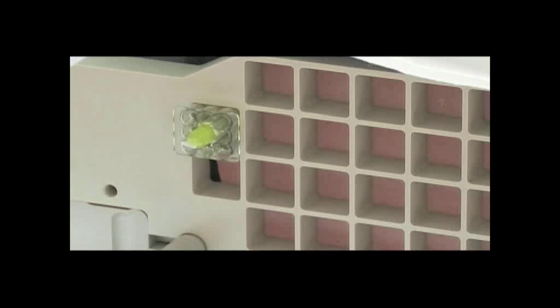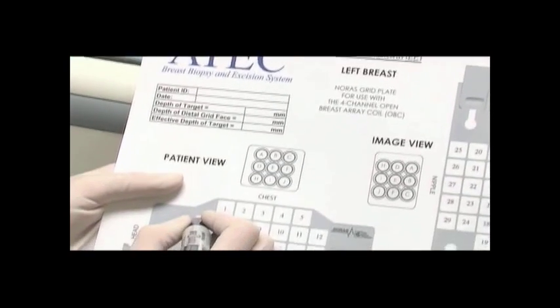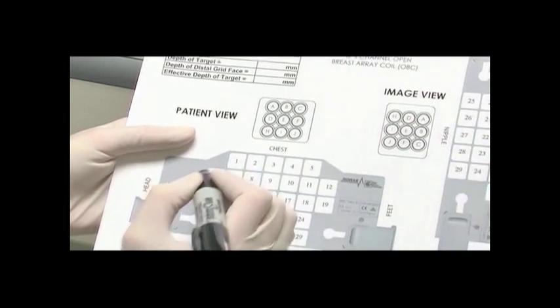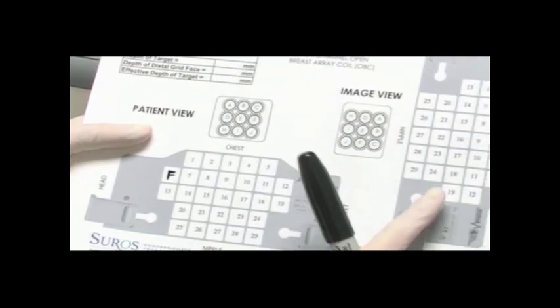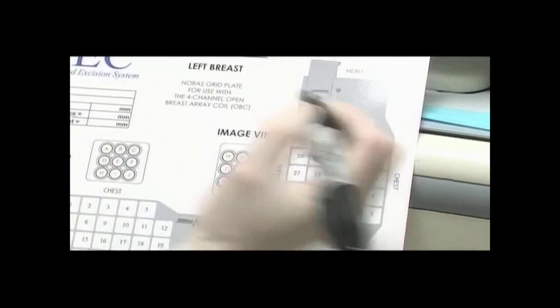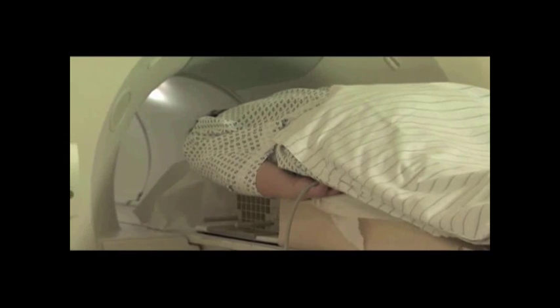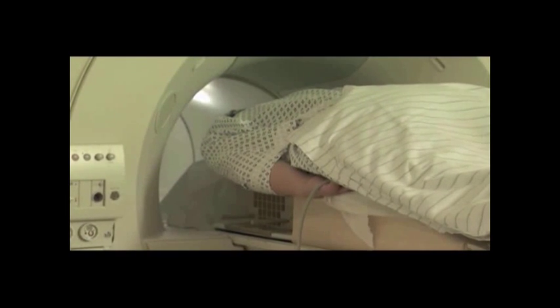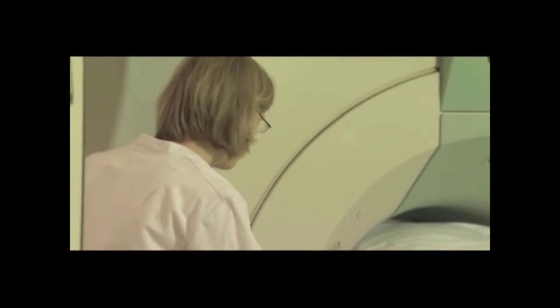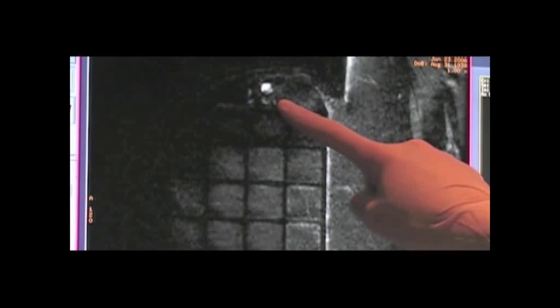It is important that the fiducial is in contact with the skin surface. Record the location of the fiducial in the appropriate grid space on the grid worksheet in the patient view and in the corresponding numbered grid space in the image view. Once the orientation is documented, shuttle the patient into the bore of the magnet for the first sequence of images. Perform a localizing scan in the sagittal view to confirm that the area of interest is located within the compressed area and ensure visibility of the fiducial.